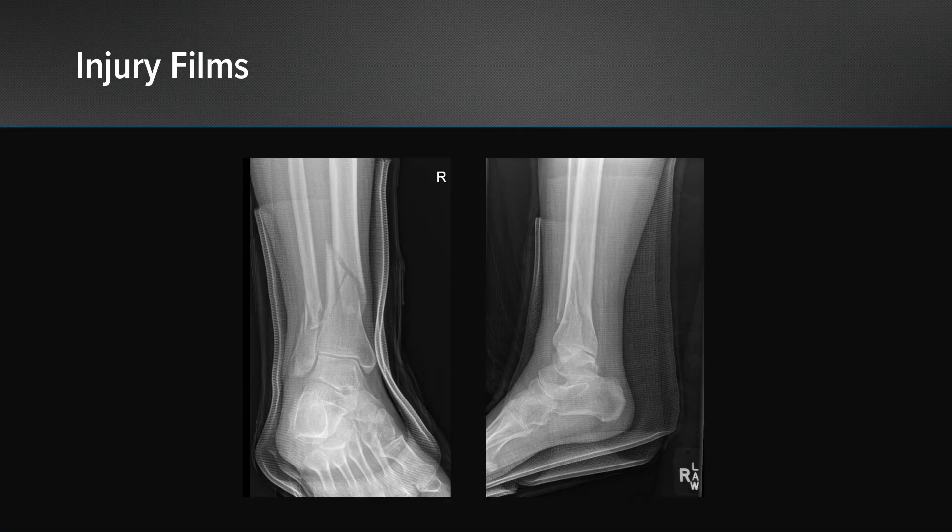This is a case of a patient with a fall from a standing height. She has a low-energy closed fracture of the distal third of the tibia. It is extra-articular in nature. The injury films show that this was a valgus failure pattern. There is a butterfly fragment along the lateral cortex of the tibia, and it failed in compression on the lateral side, tension on the medial side.